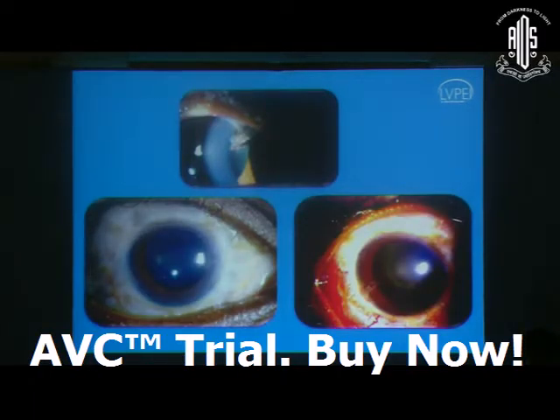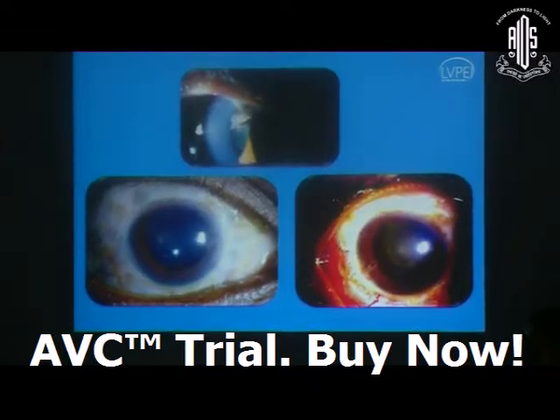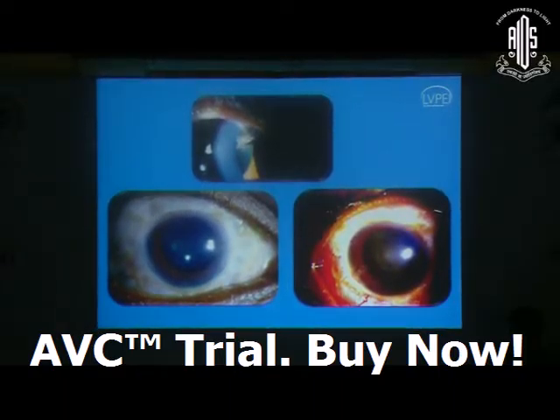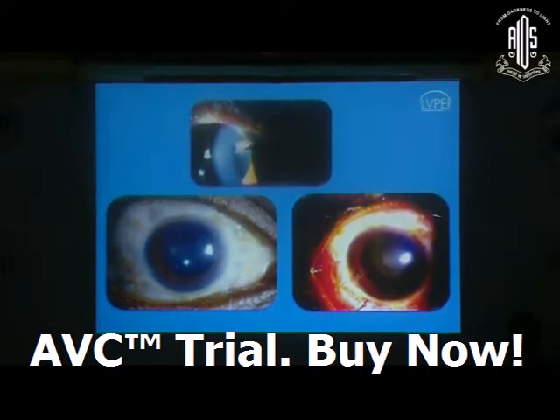Sometimes you can have a silicone oil blocking the tube, which is sometimes very, very difficult, and these are all silicone material. The tubes are all silicone material, the implant is silicone, so it has a very high affinity for the silicone oil. So it tends to sometimes form very funnily an oblong kind of a teardrop-like thing around the tube. Fortunately, it doesn't block the tube all the time, but sometimes you can have the tip being blocked like this. This is very unusual to see just a small droplet.